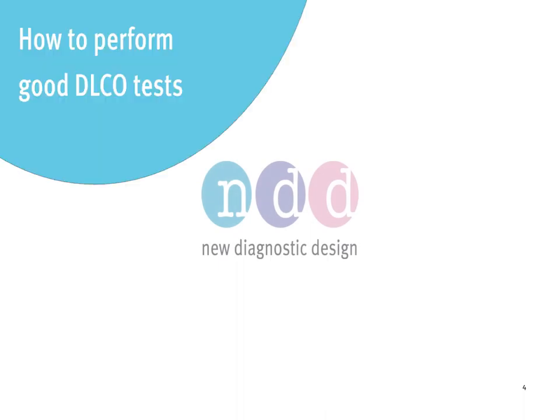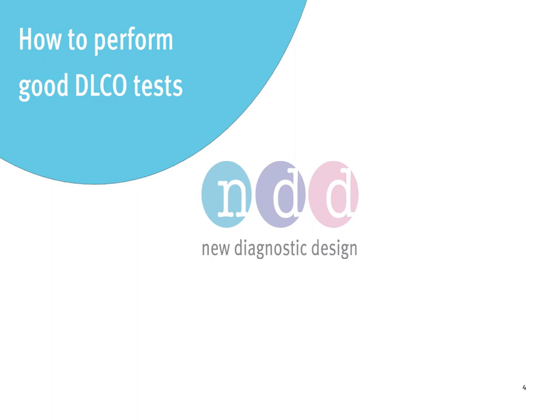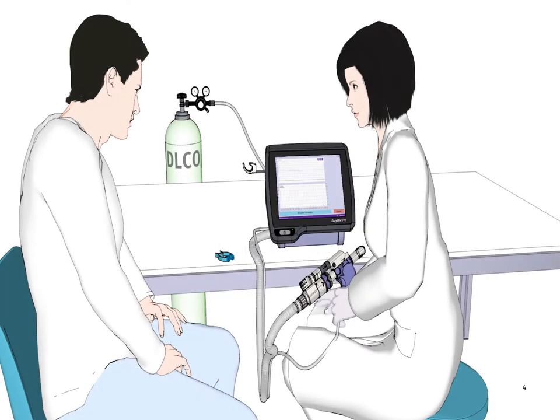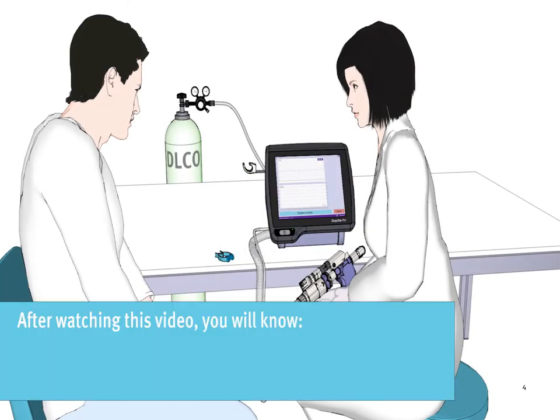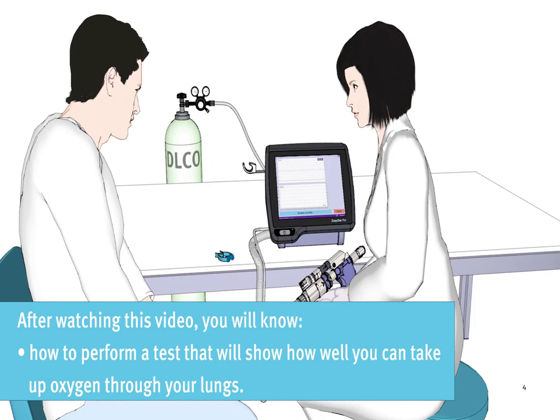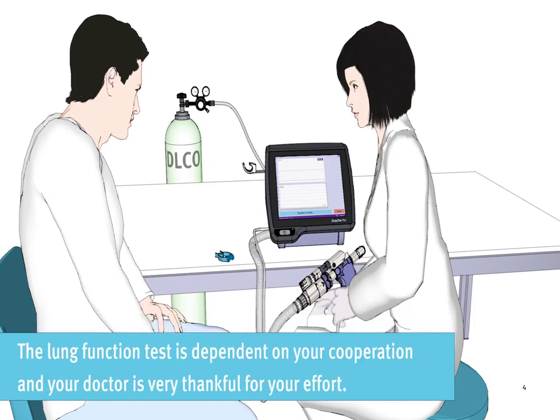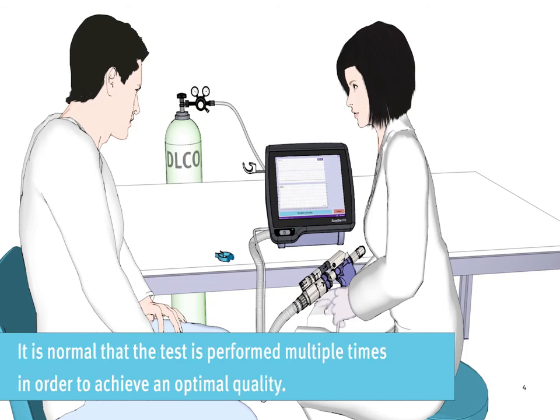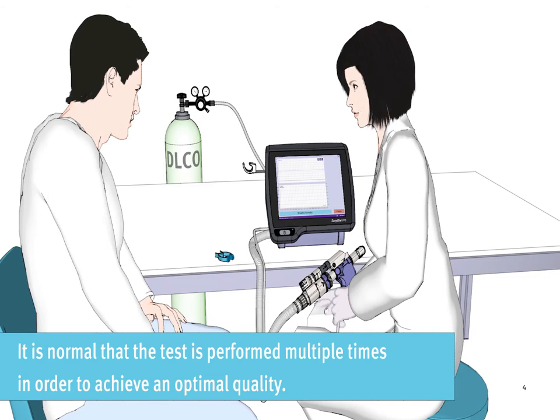How to perform good DLCO tests. After watching this video, you will know how to perform a test that will show how well you can take up oxygen through your lungs. The lung function test is dependent on your cooperation and your doctor is very thankful for your effort. It is normal that the test is performed multiple times in order to achieve an optimal quality.